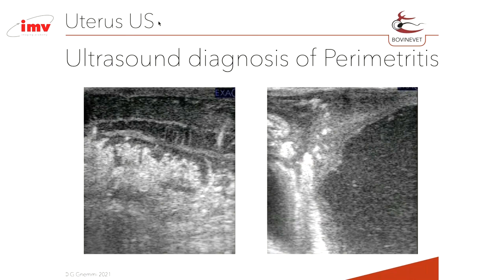So you have a perimetritis that sometimes is dangerous for the life of the cows, and in the best condition, when the cows survive, we have adhesions which don't permit us to use these cows for reproduction, because the uterus is connected with the abdominal wall, ventrally, laterally with the rumen, or sometimes with other abdominal organs.